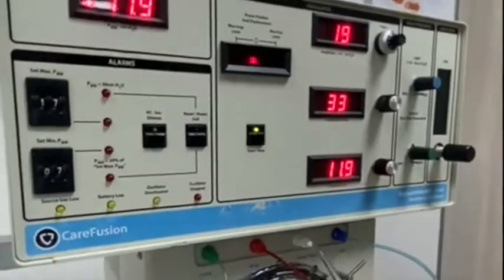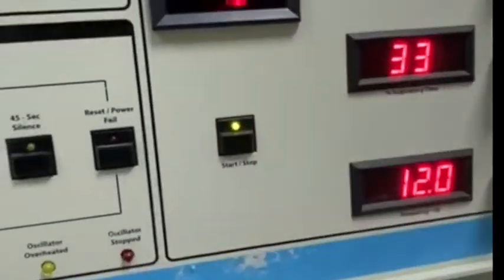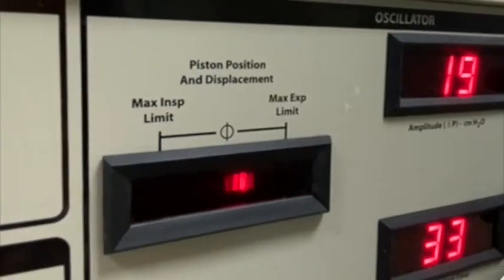Press on the start button and adjust the piston position. It must be in the center, and the circuit must be straight to deliver the wiggles correctly.